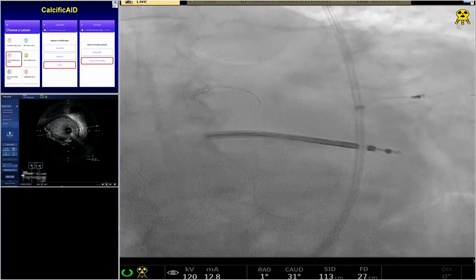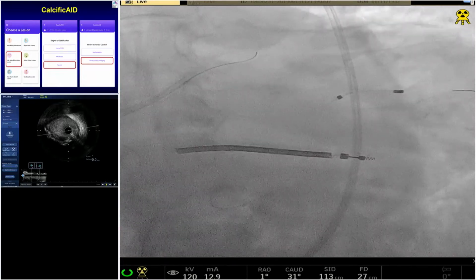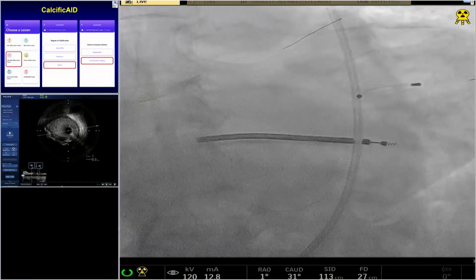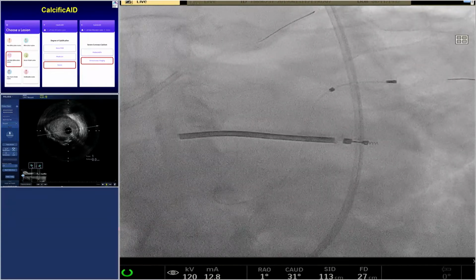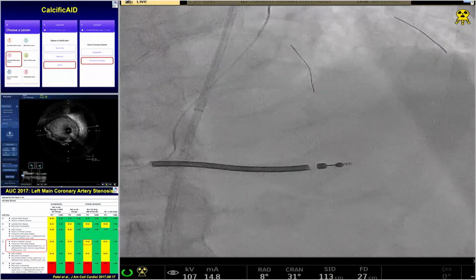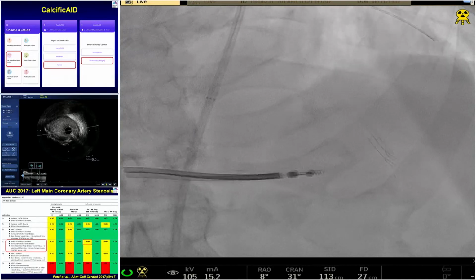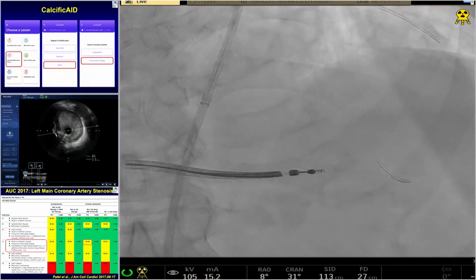Okay, Dr. Kinney, take us through your calcific aid. You can see the calcific aid going through one of the top slideshows there. As soon as you enter, you decide which tab you need to pick. Here it will be left main, because we are going to work on the left main. Already angiographically we knew that it is significant calcium, so there's no need to IVUS the LAD. But we did the IVUS of the circ. If we can show the IVUS of the circ, you can run the whole IVUS, and then we have some measurements. Ostial circ we got just about 4.